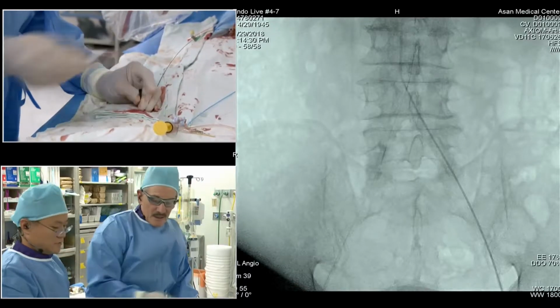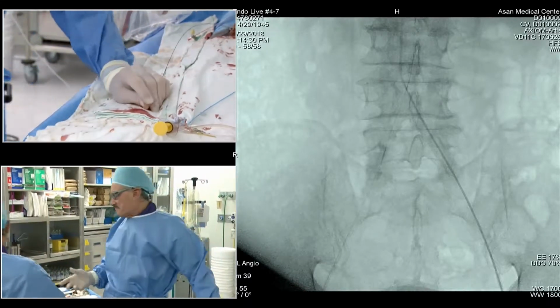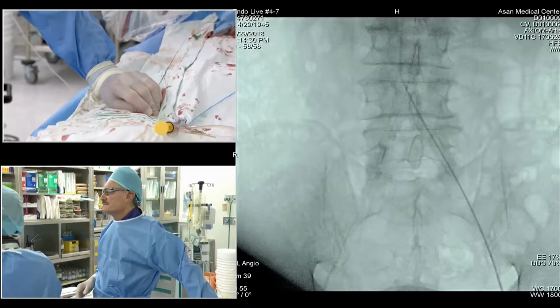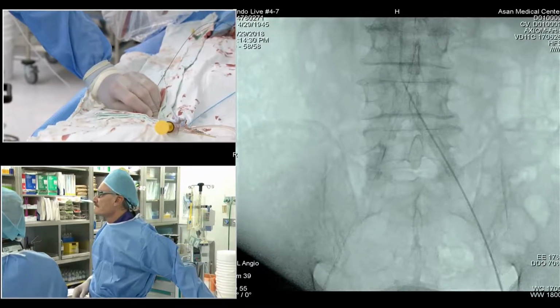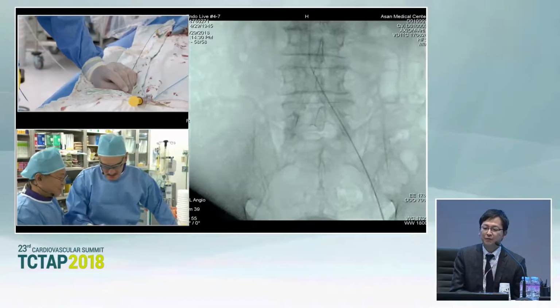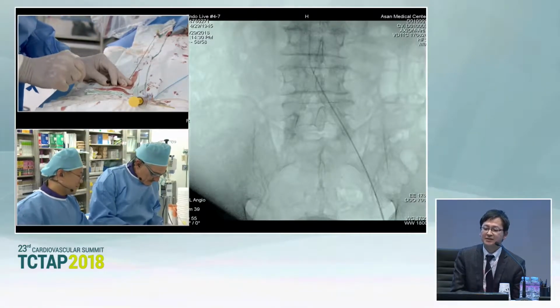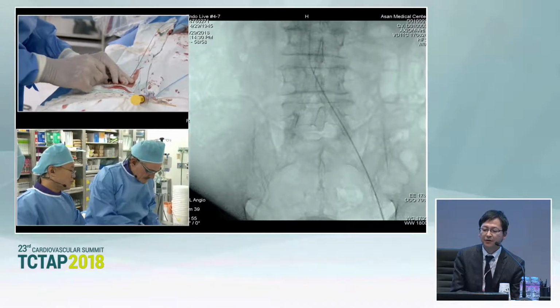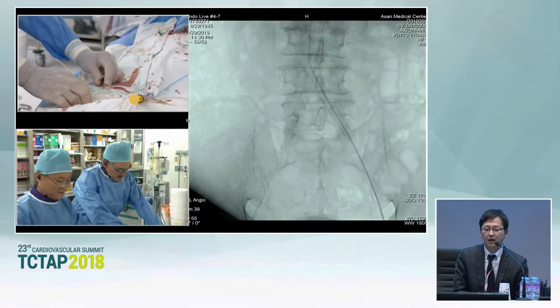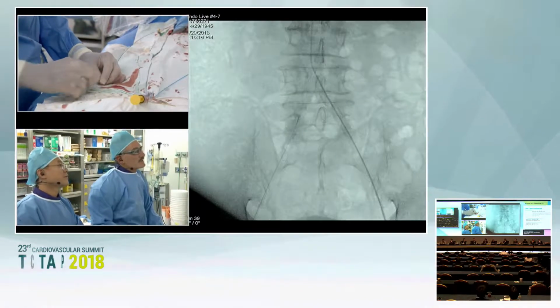Okay. Let's now take a support 018 wire. Do you have an extra support, Dr. Bassi? So I have a comment about the recanalization point. Should we perform the IVUS just for assessing the ostial recanalization point? Honestly, I think I'm through the true lumen the whole way on this approach.